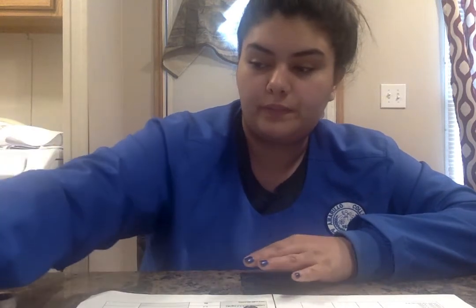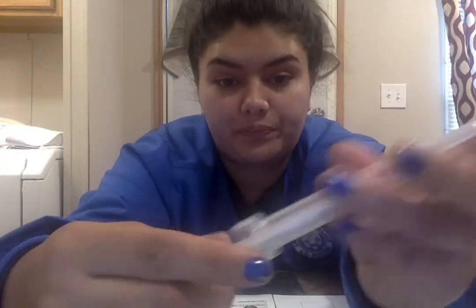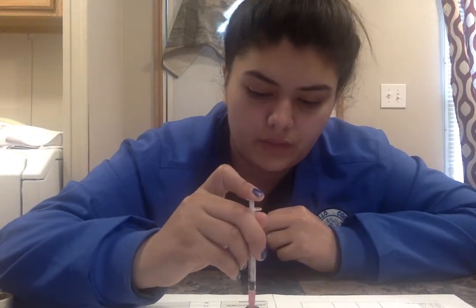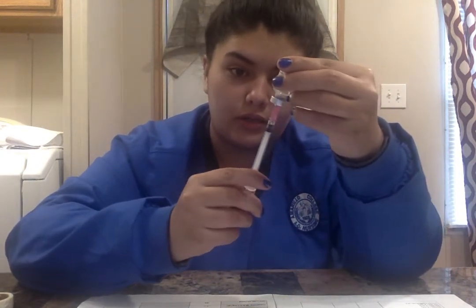We're going to clean the top of this vial. This is a multi-dose vial, and so we're going to inject air into it. We're going to get our 1 milliliter syringe. We're going to take it out of its clean compartment. We are going to open it. We are going to have the 0.1 mL of air, and we're going to inject it directly into the vial. Then we're going to invert. We're going to withdraw 0.1 mL.